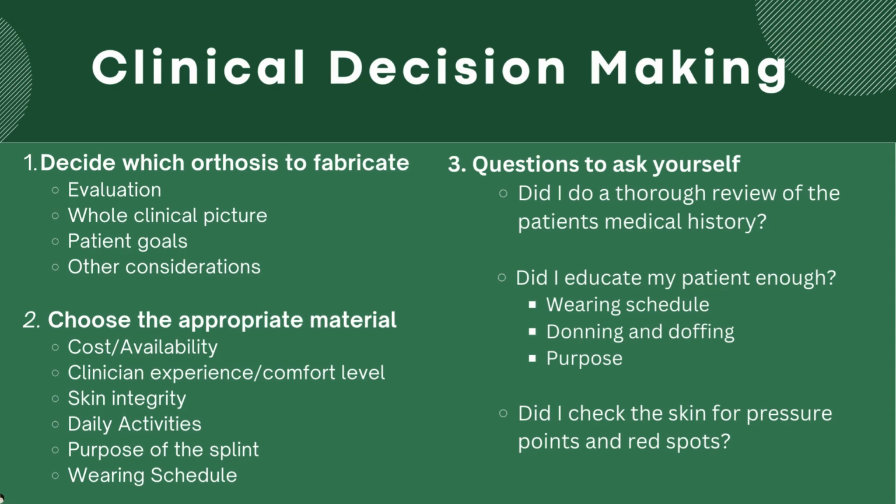And then finally, I like to ask myself, did I check the patient's skin before they left for any red spots, any pressure points, any wounds or any skin abrasions? You always want to make sure the patient leaves safely and comfortably. And I always have check-ins with my patients. So I always tell them to call or check in within a week to make sure that everything is fitting properly.